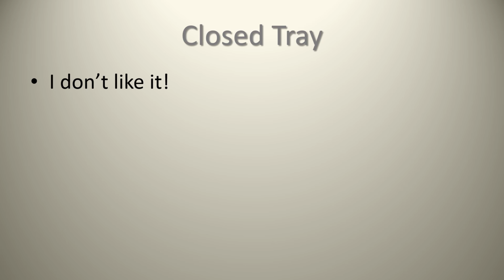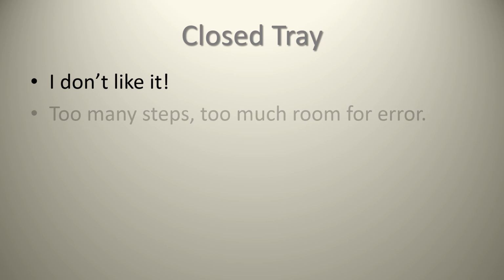There's too many steps in using a closed tray impression technique. There's just too much room for error, too many parts, too many things that need to snap together, just too many things that, when you start introducing too many steps, there's always going to be room for error. So that's what I find with closed tray. It just looks like it's going to be problematic.